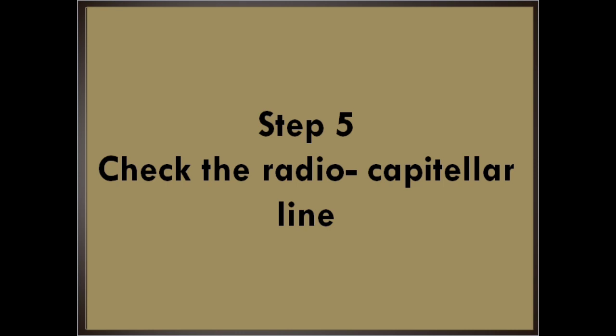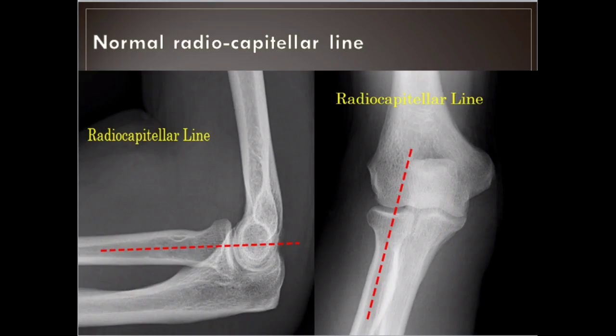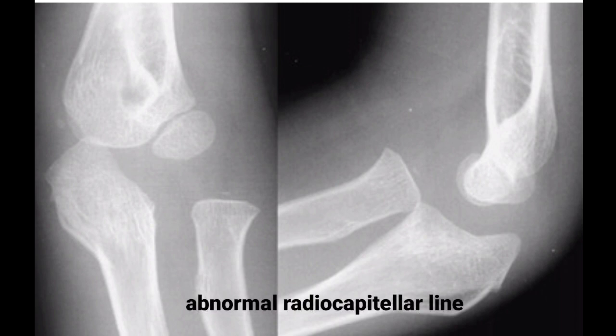Step 5: Check the radiocapitellar line. On any view of the elbow, a line drawn through the middle of the radial shaft should pass through the capitellum. If the line misses the capitellum on any of the elbow views, dislocation of the radial head is present. This image shows normal radiocapitellar lines. This image shows an abnormal radiocapitellar line — on both views, the radius fails to bisect the capitellum, indicating an obvious radial head dislocation. Also note the anterior and posterior fat pads, as well as the obvious olecranon deformity. A radial head dislocation with an olecranon fracture is called a Monteggia injury.